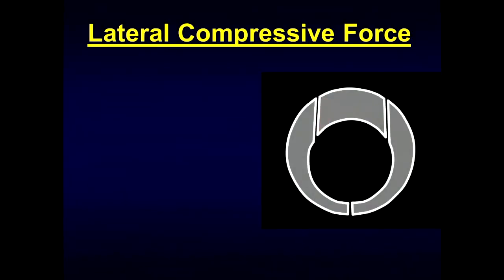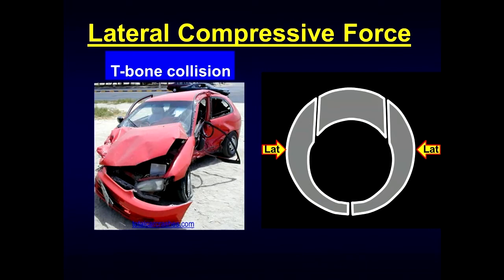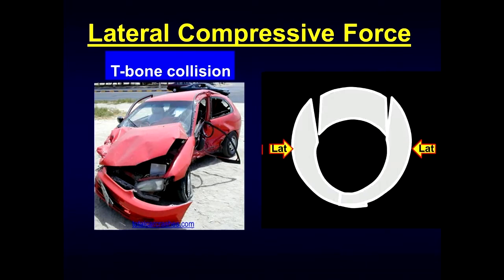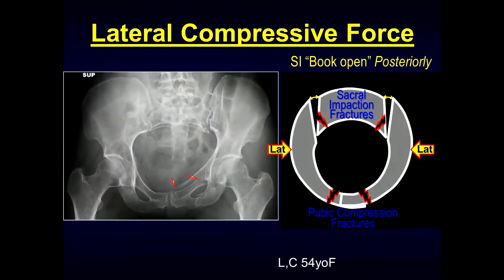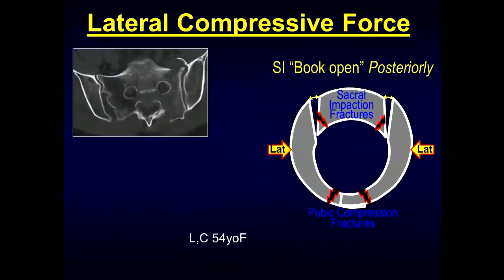Moving on to lateral compressive type forces — these are commonly seen following a T-bone collision. What occurs here is pubic compression fractures, sacral impaction fractures, and the SI joints can book open posteriorly. On the radiograph with this type of injury we can see the pubic rami fractures, that inferior pubic rami fracture, and the contralateral other side showing pubic fractures and fractures of the sacrum. On CT, we can see that sacral fracture as well as the widening posteriorly of the contralateral sacroiliac joint.